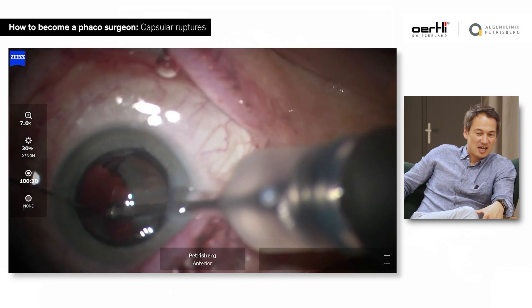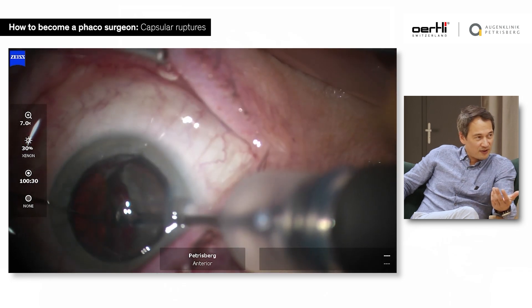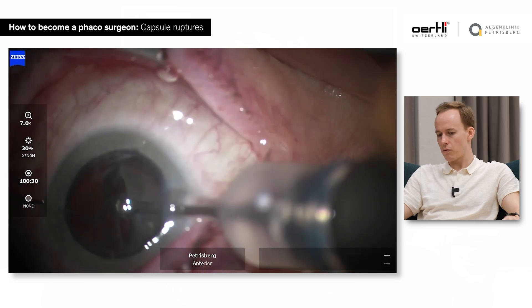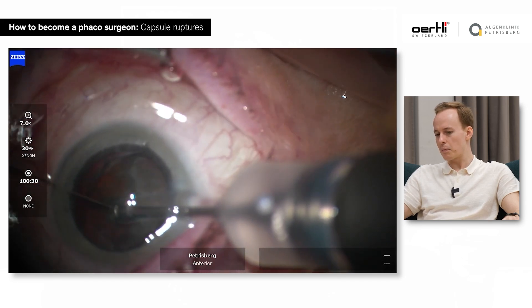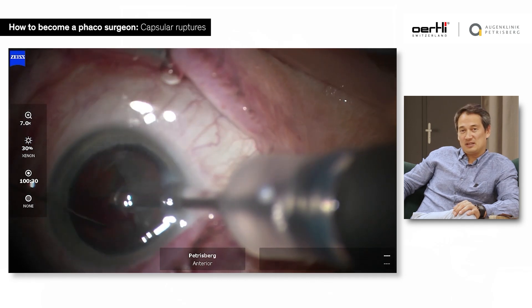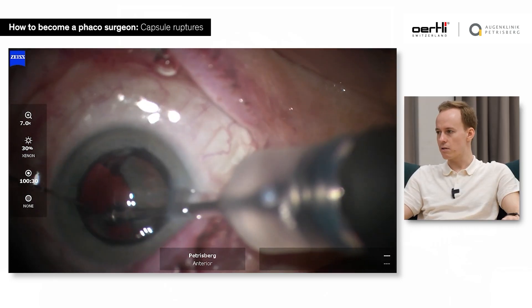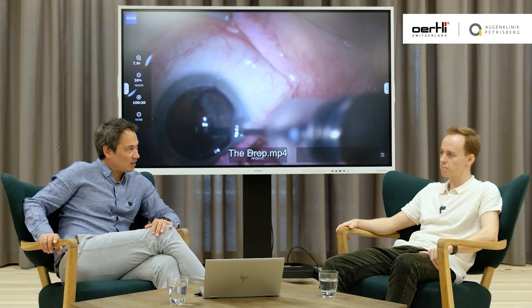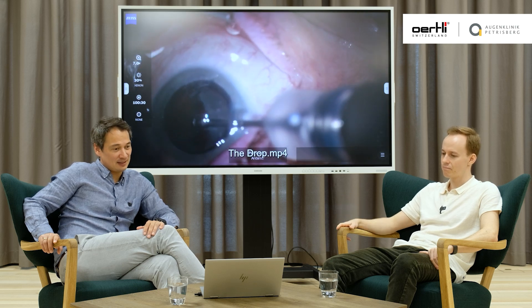This is another problem that can happen when working with quadrants — finding the sweet spot between occlusion, phaco energy, and holdability is very hard. Sometimes you just have a rupture and it's so fast you don't even know where it's coming from. There are ruptures that you notice, and they are just there and you don't know what happened. These are probably the most painful ruptures — painful because you don't learn anything from them, since you don't know what to change. It's very frustrating. Those things will happen. Just stay calm, take a deep breath, try to manage it as best you can, and put in OVD.